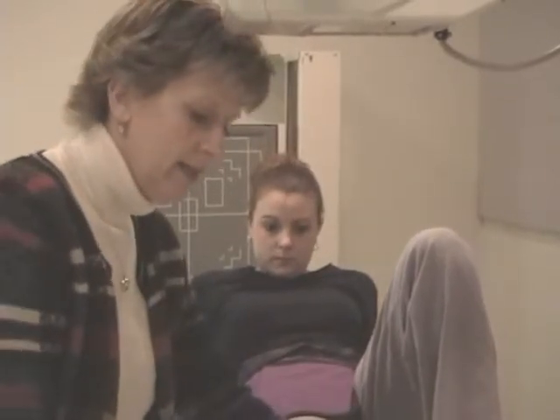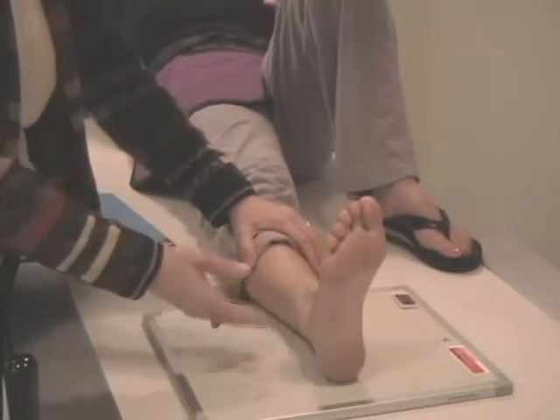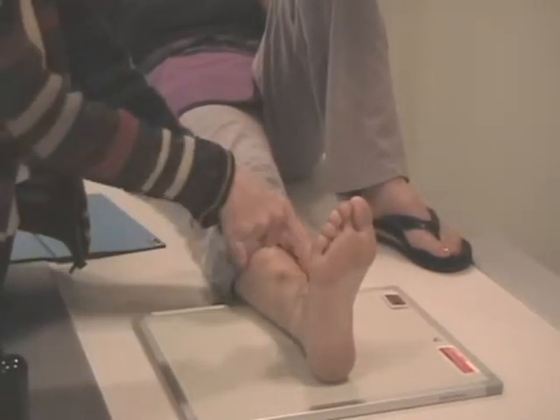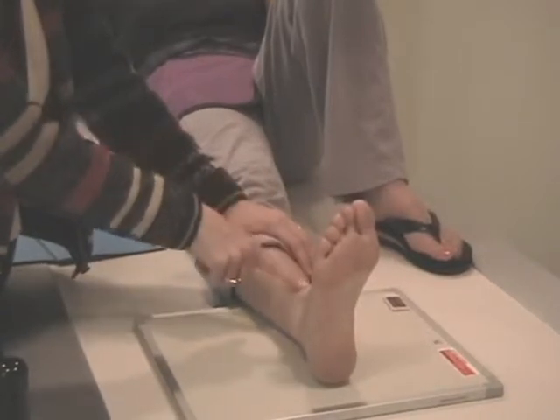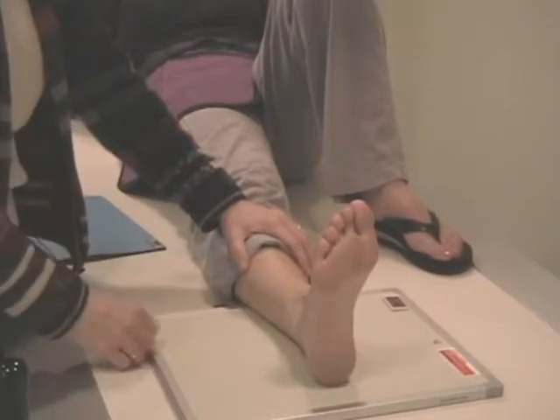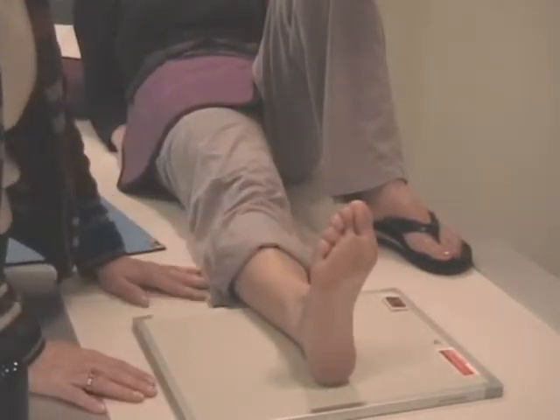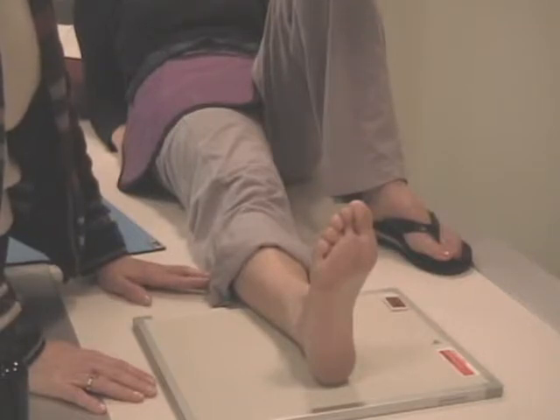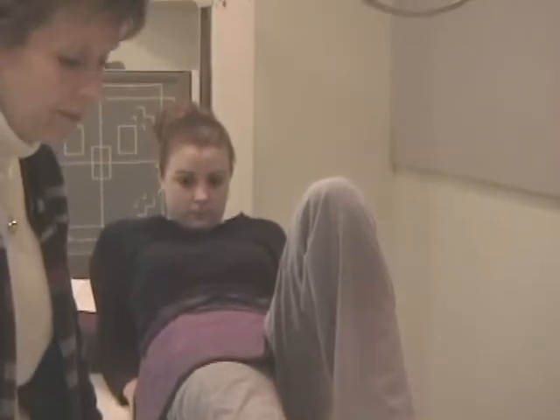The AP is done in the center. Make sure the foot is straight up in the air, flexed. The purpose of flexion is to open up the talotibial joint space, keeping the os calcis from obscuring it. Foot straight up in the air, and if you've done a good job with your AP, the fibula will be slightly superimposed over the tibia and the talus.